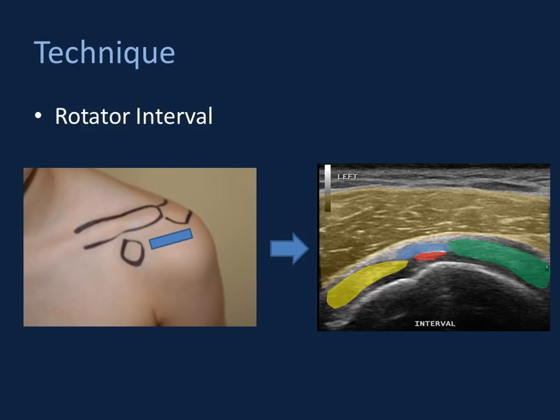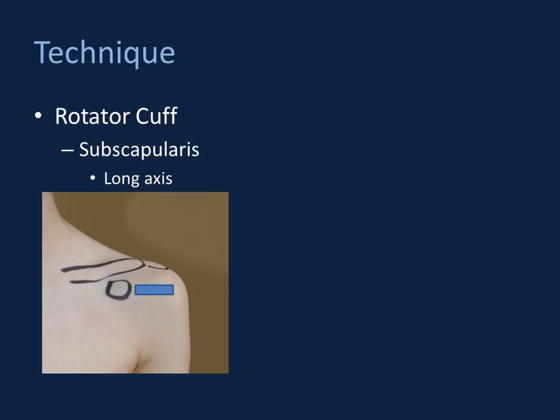The first rotator cuff tendon we'll look at is the subscapularis. Imaging the subscapularis is best performed with the patient's arm externally rotated, since it attaches onto the anteromedial lesser tuberosity. Real-time imaging is done dynamically with some internal and external rotation to profile the lesser tuberosity. Your marker for imaging the subscapularis is the coracoid process. We take the probe and position it roughly horizontal — though the subscapularis has a slight caudal-to-cranial orientation peripherally, so you may need to angle the probe.